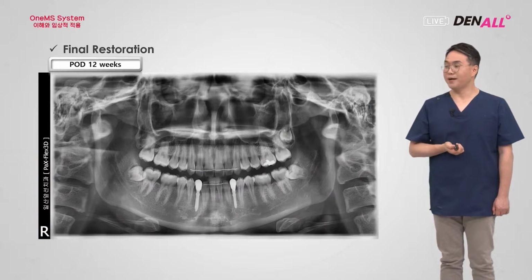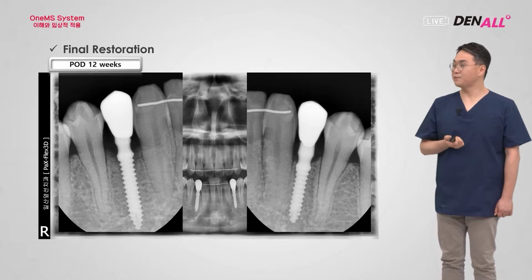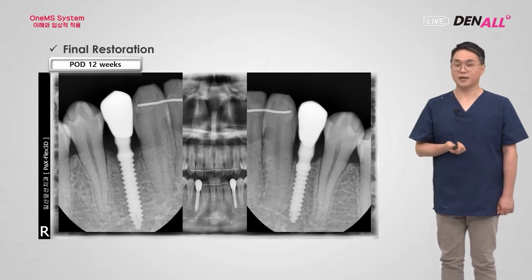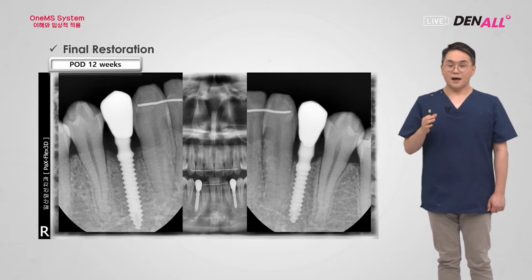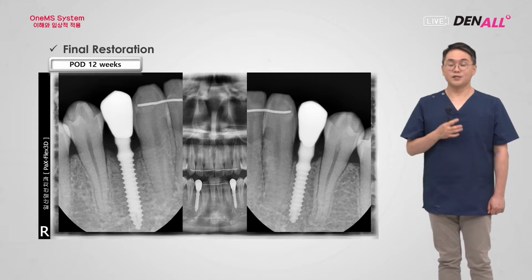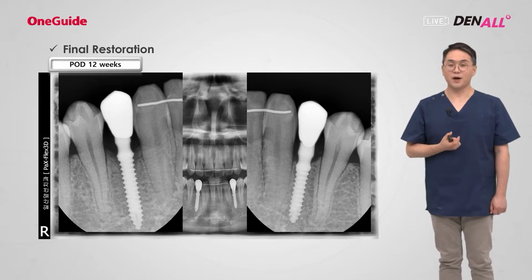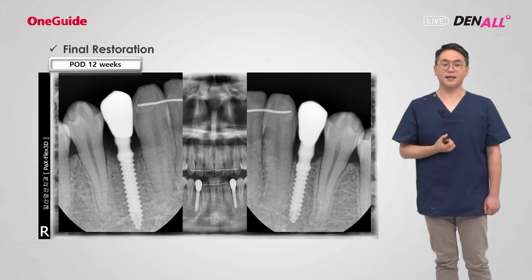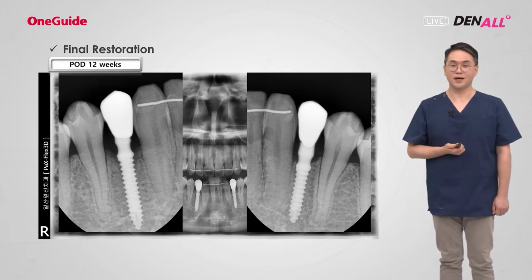After the final restoration, in the panorama and PA pictures, without much bone resorption, you can see it's healing nicely. So I showed you on the upper and lower anterior part how to do guide surgery with actual cases, and we looked at the OneMS Kit and how to treat a single missing case on the lower anterior side, and how the implant can be placed easily.